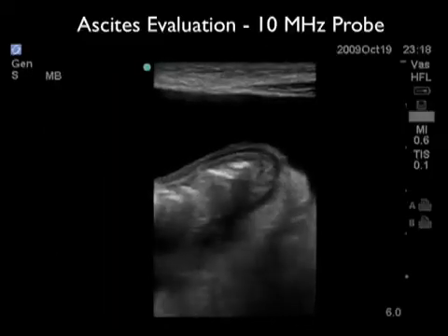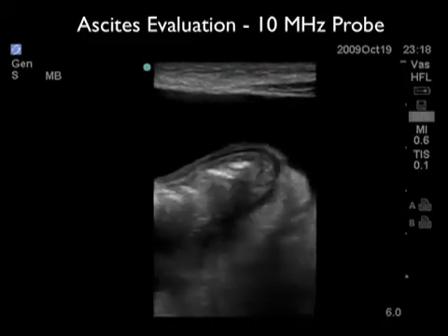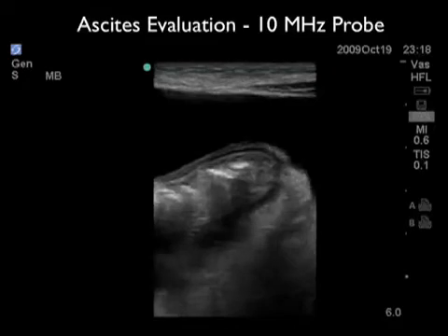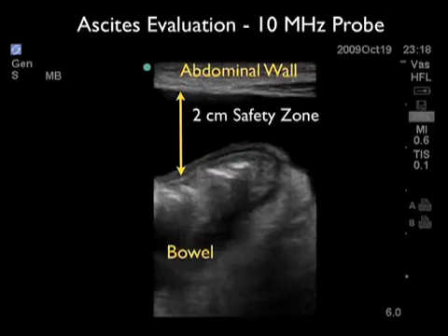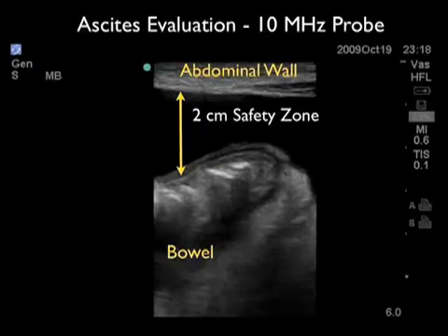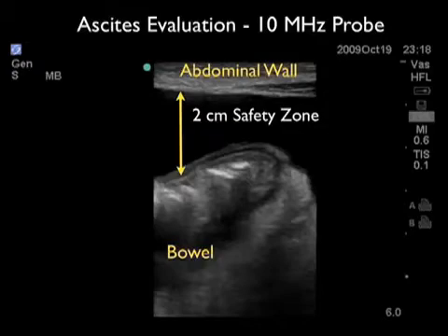This video clip emphasizes that using a higher frequency 10 MHz probe on the abdominal wall gives a more detailed evaluation of the ascites in relation to the intestine. We can see the abdominal wall anteriorly and bowel floating within the ascites. Here we can actually mark and measure the safety zone in which a needle could safely go through the abdominal wall into the ascites without hitting bowel. The safety zone here is approximately 2 centimeters, as marked out with the centimeter dots towards the right of the image.